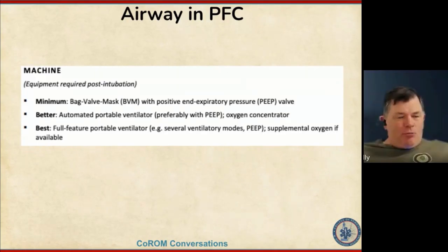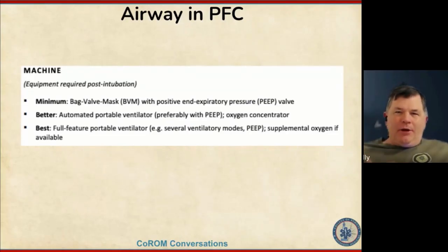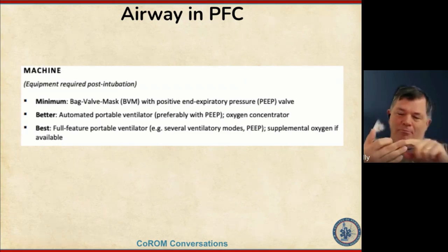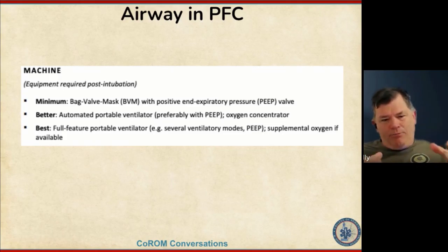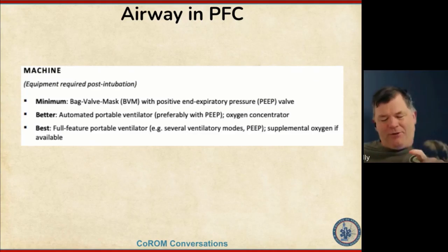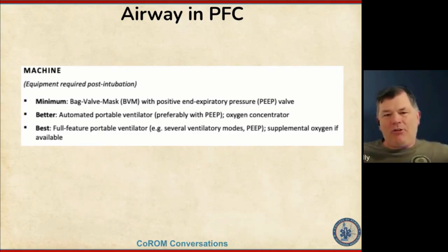The PEEP is really important, and I didn't quite understand it until I was like, okay, how am I going to know what a 5 PEEP is, what a 10 PEEP is? So I came up with a system of getting a big straw. I measured down the length of the straw, how many inches, because it's inches in mercury or inches in water, isn't it? And then I got a big thing of water, and I put my big straw 5 centimeters down, and I blew out of it. Okay, that's 5 PEEP. Then I put it down to 10 PEEP, blew, and then I could feel that resistance, and you get up to 20.